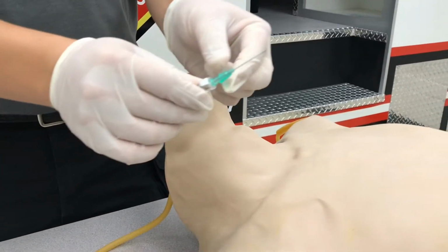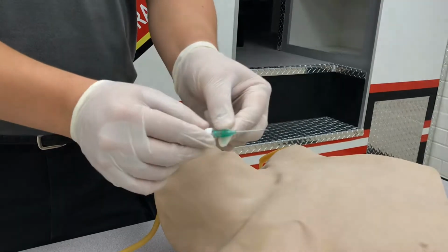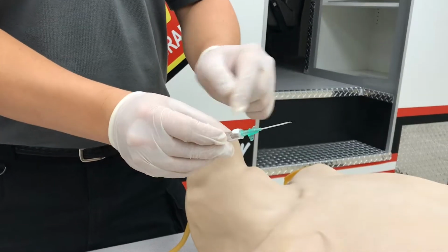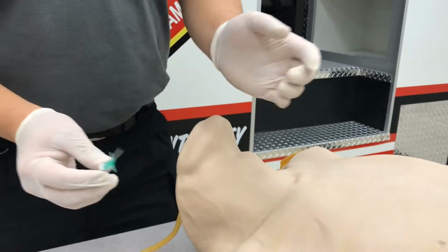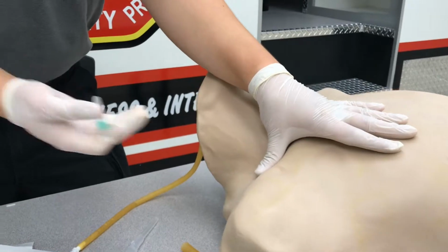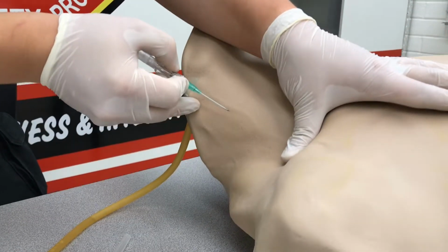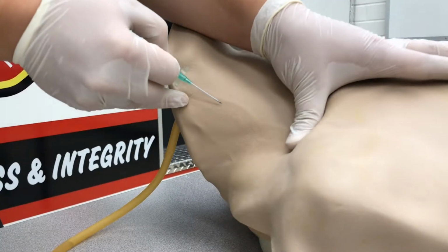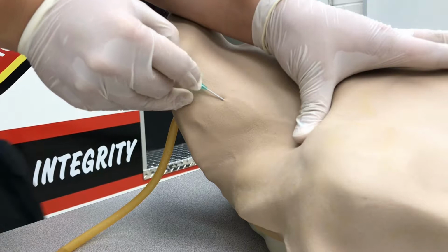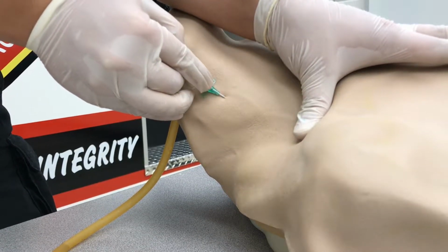And on this one, we're not actually going to spin the catheter. It's actually locked in place. And on this one, the flash, you'll actually see it come up the needle and also in the flash chamber. So just like before, we're going to brace our forearm on the jaw and also our thumb down on the clavicle to raise up that vein. And we're going to go into that external jugular at a shallow angle, feeling for a pop, looking for the flash. Okay, and we're going to just push forward on the catheter.